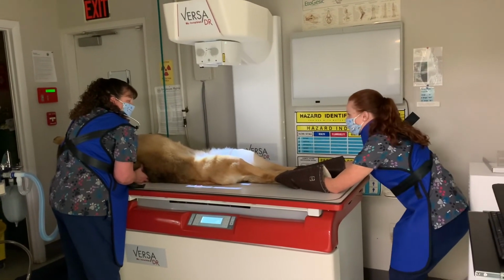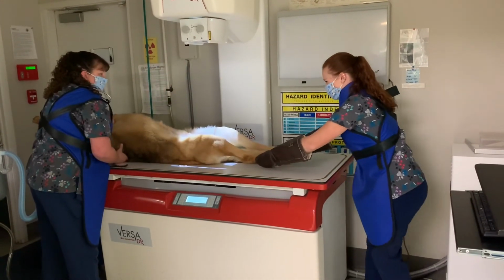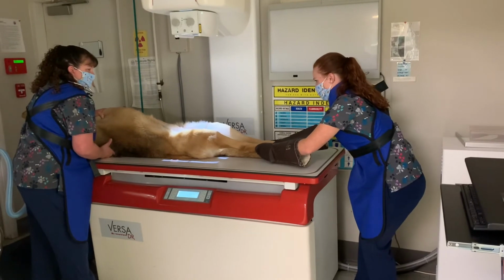Pull back. You're gonna have to rotate in a little bit more. Yep, and then go really hard. So take your hands and really rotate. There you go. See what that looks like.